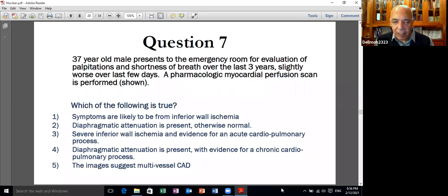In the ischemic area, you already get some vasodilatation. So you get extra vasodilatation, which is not marked. In the normal area, you don't have vasodilatation. So the vasodilator will produce extensive vasodilatation. So after giving the vasodilator, you will have two areas. A normal area with extensive vasodilatation, through which most of the blood will go, and an abnormal area with marginal vasodilatation, through which the blood will not go. So this is the differential distribution of blood.